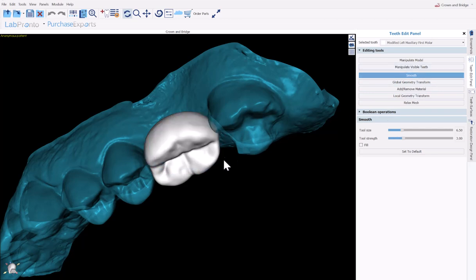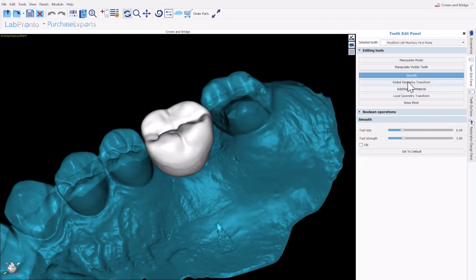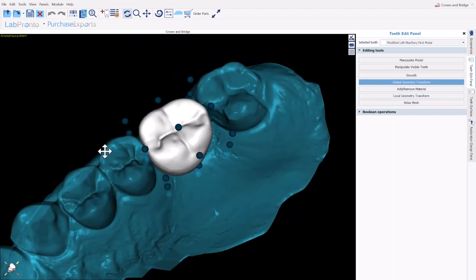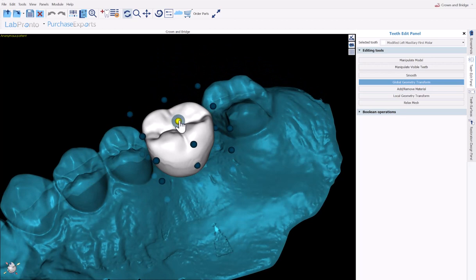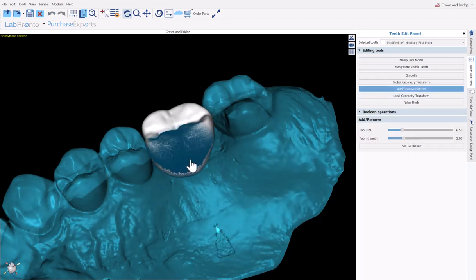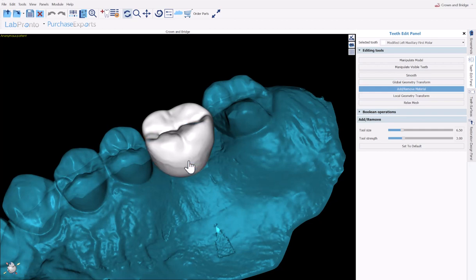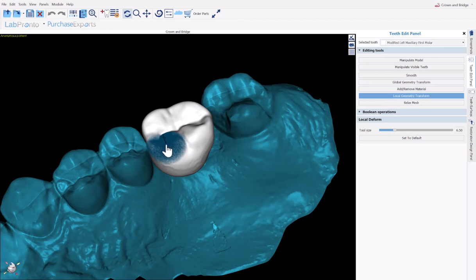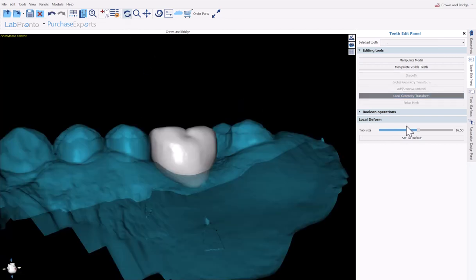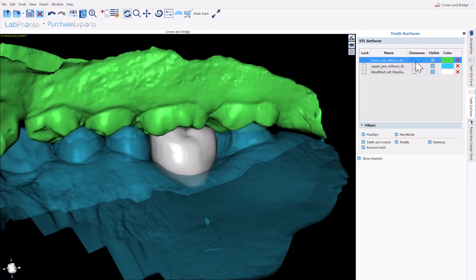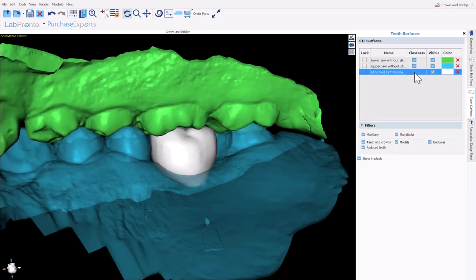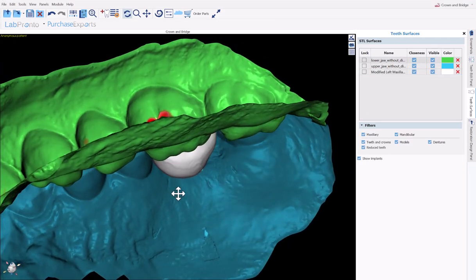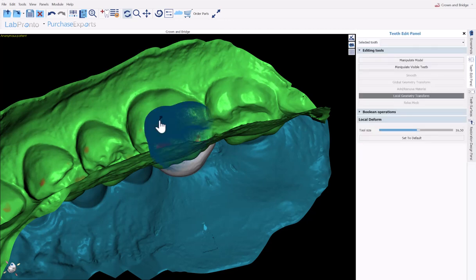We have our smoothing tool that does exactly that. Hold down the shift key, use your left mouse button to smooth out. We have our global geometry transform, which as you could see, puts a matrix of dots on the tooth, and you could just grab and drag and change the shape that way. We also have add/remove material. If you hold down shift and use your left mouse button, you'll be adding material. If you hold down control and use your left mouse button, you'll be removing material. We have local geometry transform with a small tool size. You could affect a small part of the tooth. If you make that tool size significantly larger, then you could affect a large part of the tooth. For example, I could toggle on the opposing arch. I could also use the closeness functionality for a red indication about contacts. And then I could use the editing tools to modify the tooth as needed.